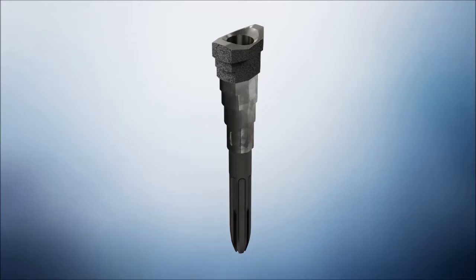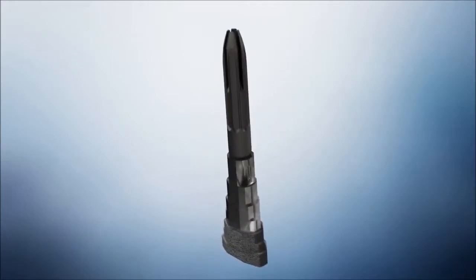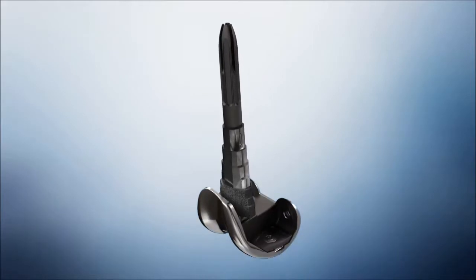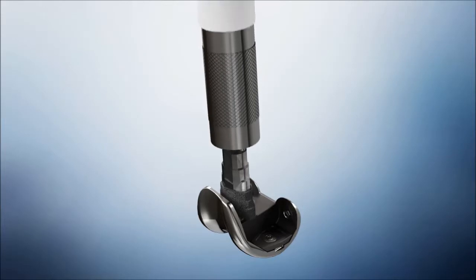Place the assembled sleeve and stem construct on top of the femoral adapter assembly, ensuring that the medial side of the sleeve is pointing medially. Use the femoral trial construct to help set the final sleeve and femur implant rotation. Utilize the femoral stem and sleeve impactor and a mallet to engage the 2 constructs.